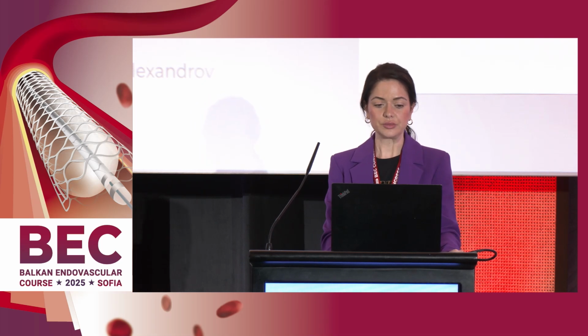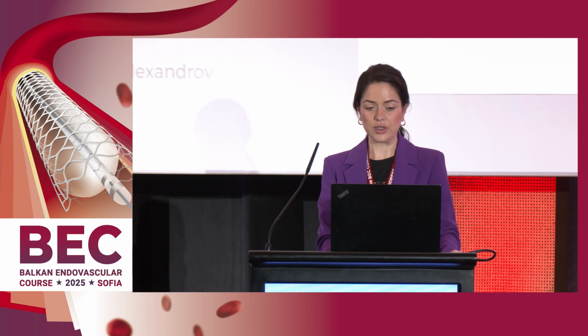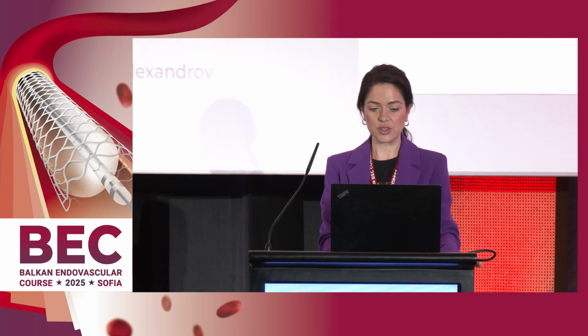arteriovenous fistulas. Conditions leading to difficult visualization of the visceral arteries are obesity, dyspnea, shadows of arterial calcification, elongations, and arrhythmias. Stenosis of celiac trunk. The stenosis of celiac trunk may be asymptomatic thanks to the collaterals created by the superior mesenteric artery or the congenital anastomosis of the visceral circulation.